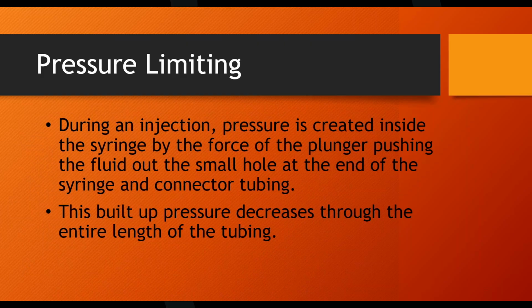So they'll have 4 or 5 or 6 protocols stored in memory. When the patient shows up, they don't start typing all the numbers. They'll just say it's an AP chest, anterior posterior chest, meaning it goes in the front and out the back, and pull it up from memory instead of typing in all the numbers.